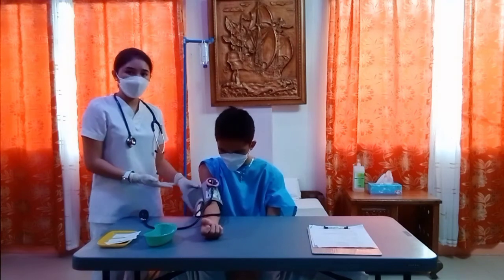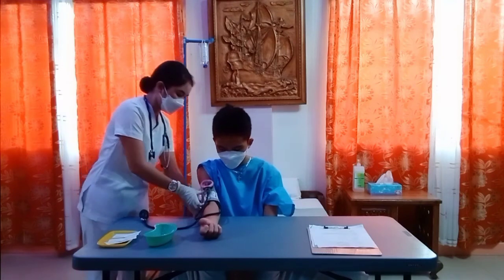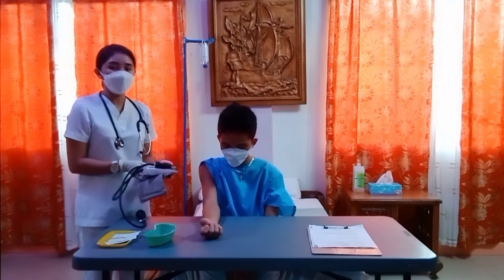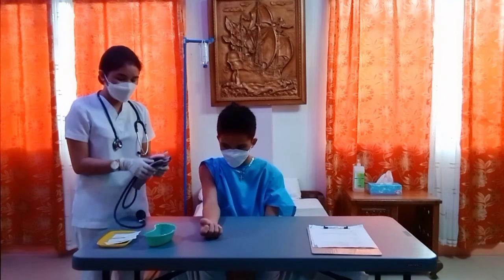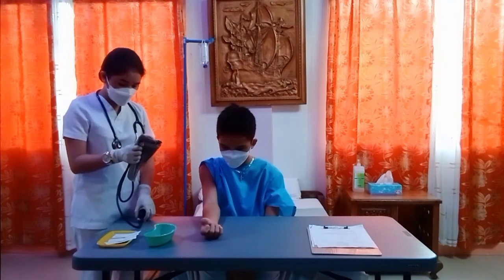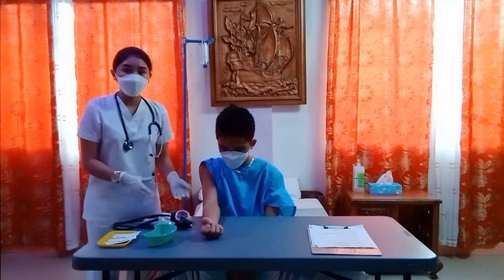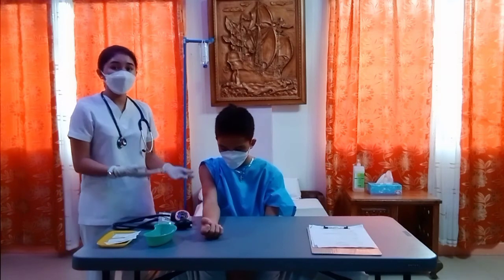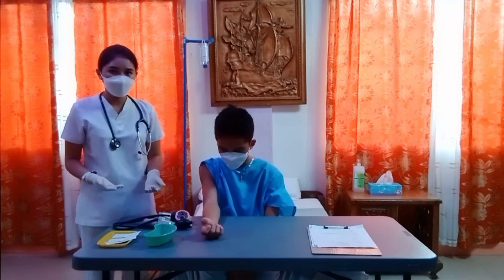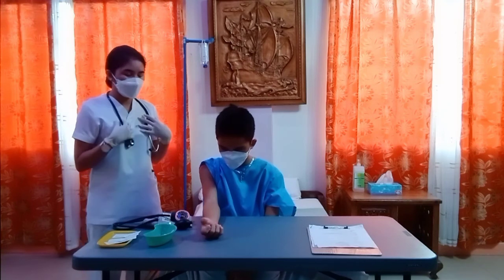What I did earlier, I released the valve completely because continuous inflation can cause arterial occlusion, which leads to numbness and tingling sensation in the client's arm. Remove the cuff away from the client's arm to allow the blood trapped in the blood veins to be removed. Next is to inform your client with the findings.